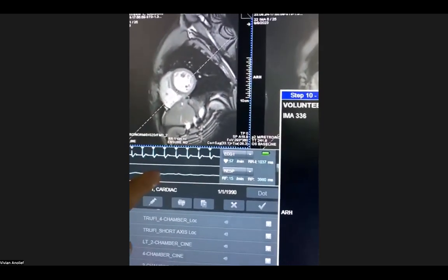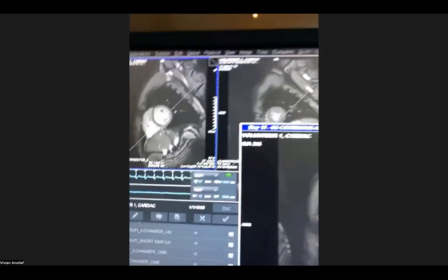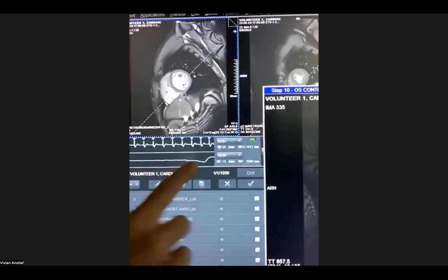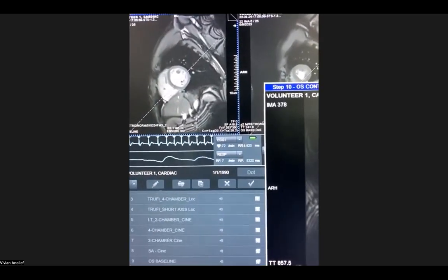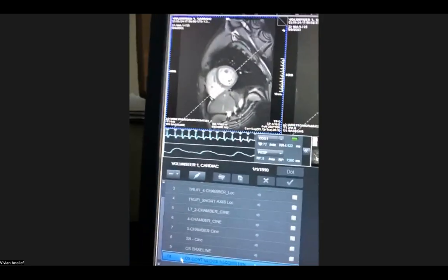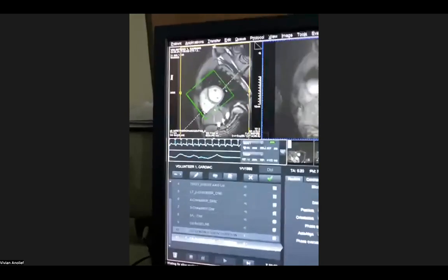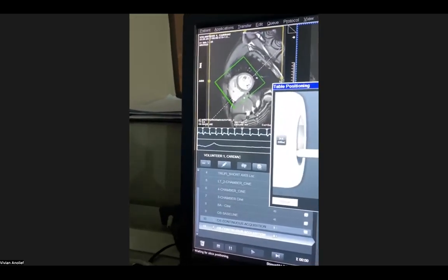I think he's not doing it. No. Let's stop the acquisition. You said deeper and fast. He's not doing it. He's just holding his breath, you see? Now the line's flat, so we can see that he's holding his breath. So we'll stop the acquisition and we'll do it again. We're just going to send Wally into the scanning room to talk to him, make sure he understands to breathe deeply and with the metronome. And then we'll try it again.